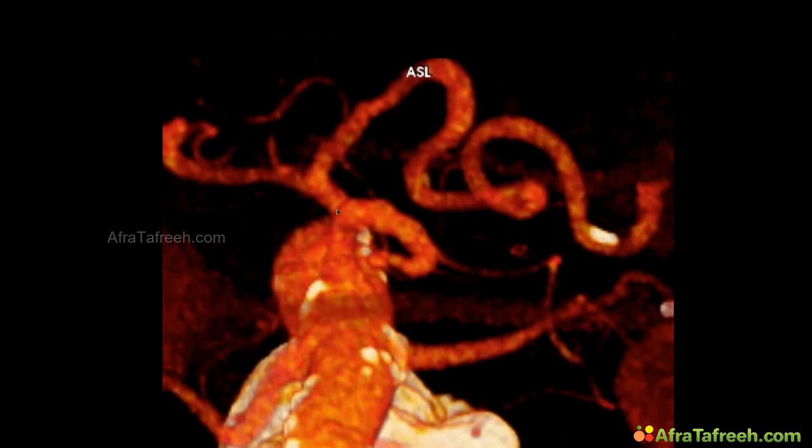You can take it more closely. Celiac trunk, splenic artery to the patient's left side, and common hepatic artery to the patient's right side. We have already seen this in the last picture. The first branch over here is celiac trunk, and only a small step inferior to the celiac trunk, the superior mesenteric artery originates from the aorta, follows a vertical course parallel to the abdominal aorta, and it looks like a pilgrim leaning on the aorta.